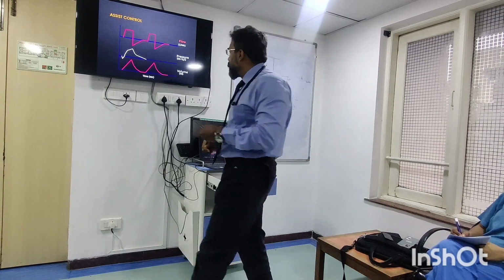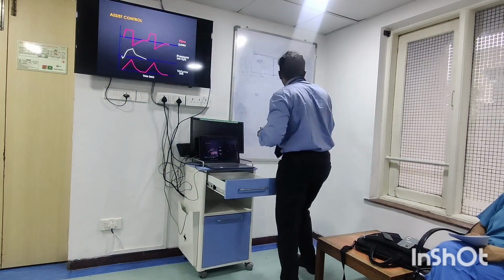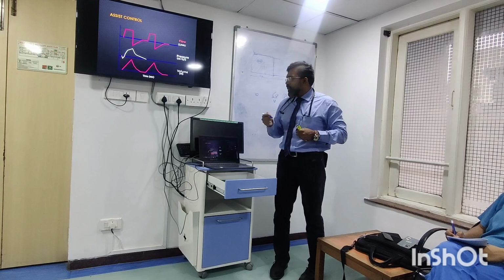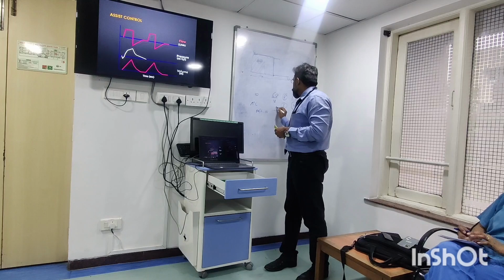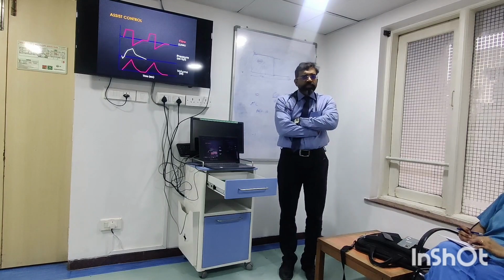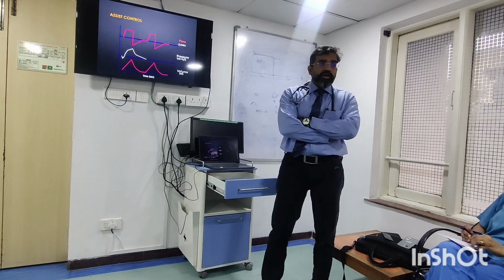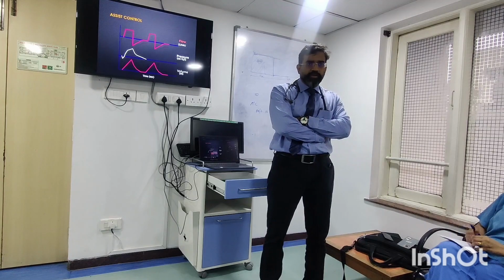This means that in this mode, if you have set a respiratory rate of 10, and the patient takes 20, what is going to happen? Say in assist control, I have set my RR or frequency as 10, but the patient is breathing 20. I am repeating this question. You have set a respiratory rate of 10, but the patient is breathing 20 times. For example, he is acidotic. He is almost triggering the ventilator, maybe 20 patient breaths are coming. What is going to happen?